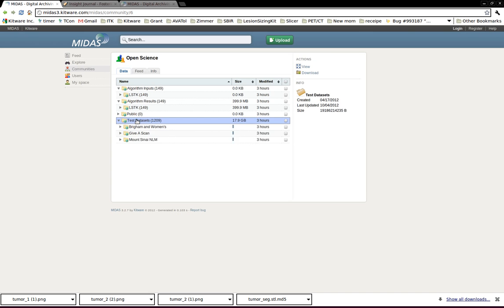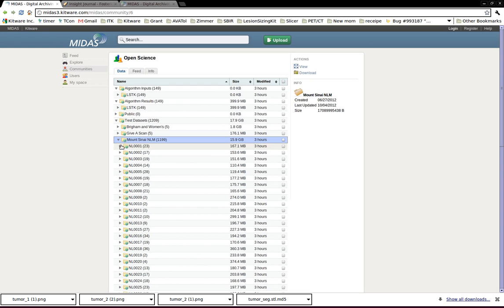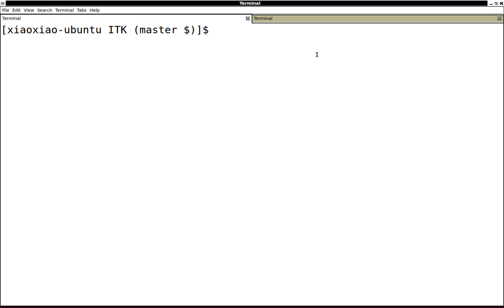If you are interested in verifying or looking at the data, you can go to this folder to download them. The example I'm going to show today is actually downloaded from here. So let's go to our source tree of ITK.